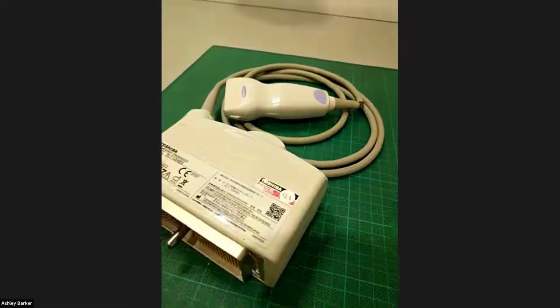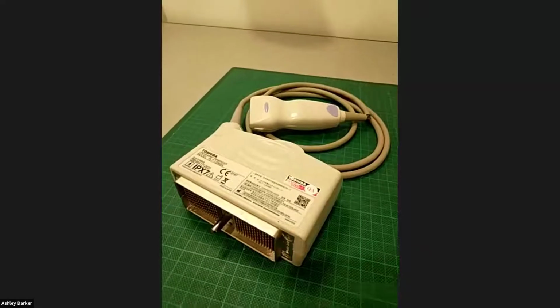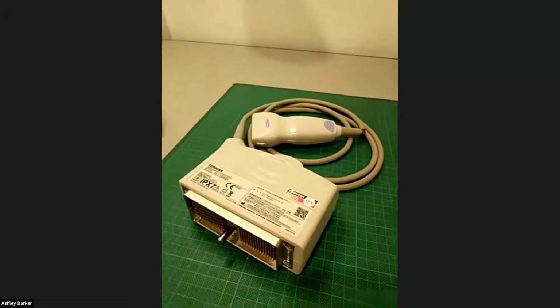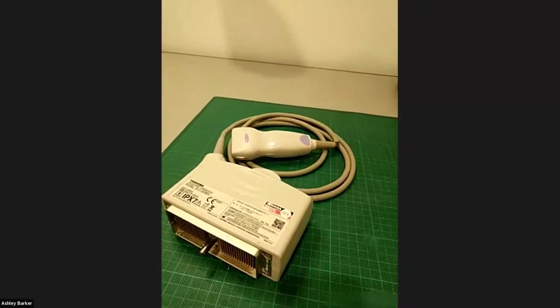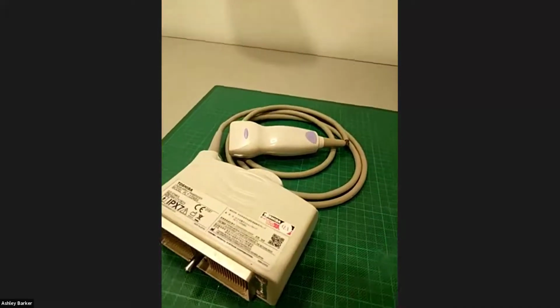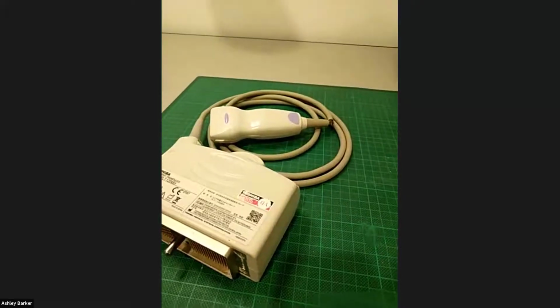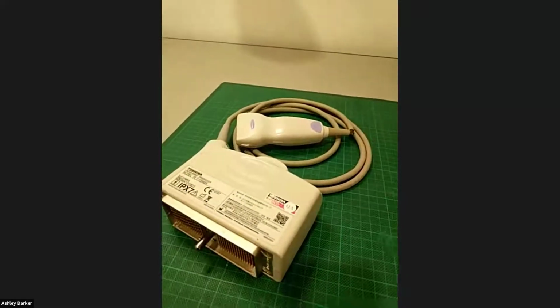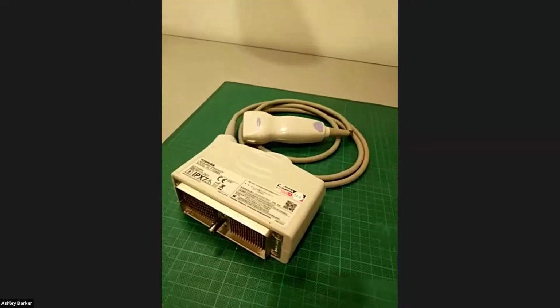Well, we had a particular local clinic over here buy them and start using them, and they just had a run where all their probes were falling apart. I felt so sorry for them. We were able to fix a large portion of it for them, but they weren't doing anything wrong. They were just using this ultrasound cleaning solution, and it just wrecked their probes. It was terrible. So definitely don't do it. If it says it's alcohol or isopropanol, don't use it. I don't care what anyone says.